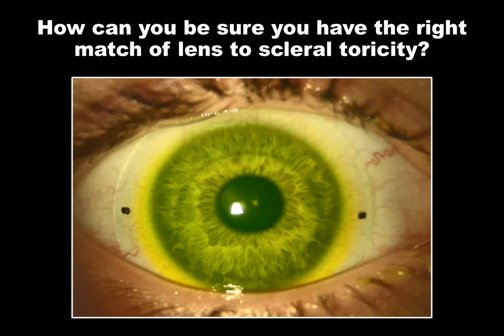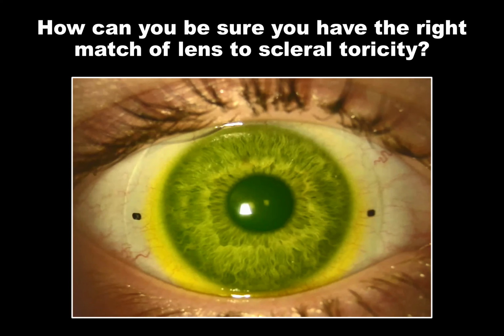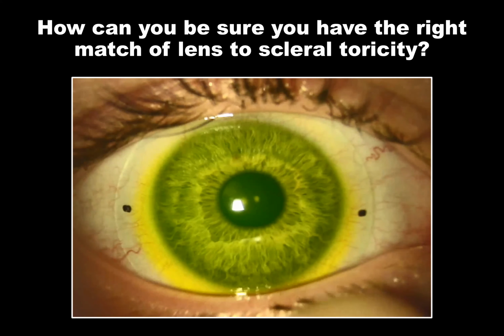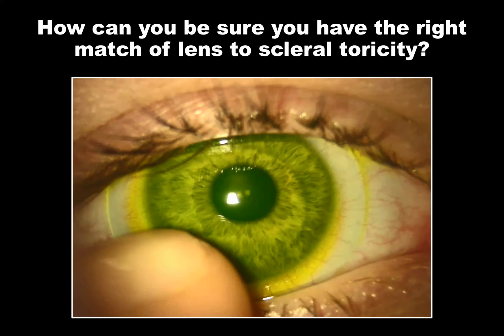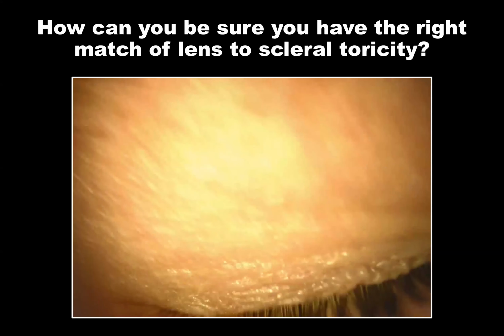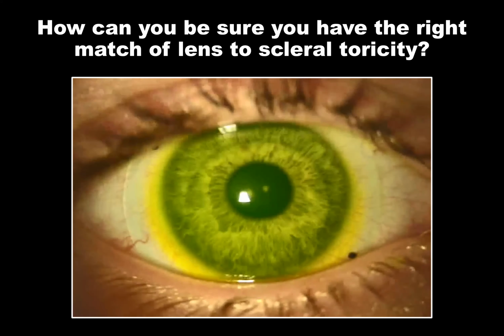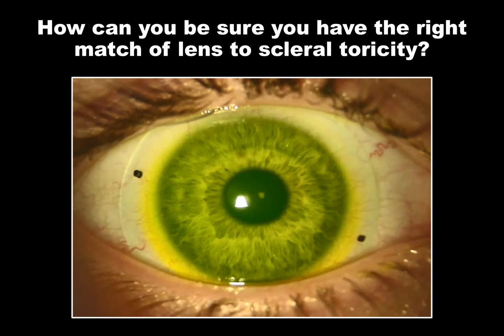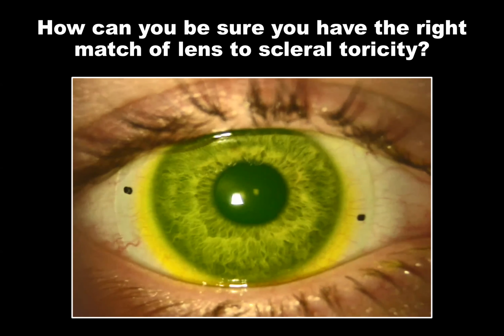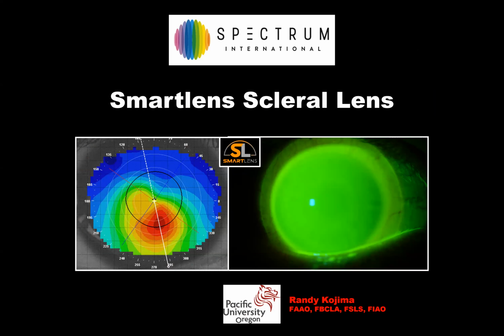So these lenses are very, very stable on eye because in the research by Greg DeNaeyer, they found that something like 6 to 10%, I don't remember the exact number, but it was under 10% of patients have symmetric scleral shape. So that means that 90% or higher have asymmetric or toric scleral shape, and therefore we really should be fitting toric scleral lenses for most eyes. I hope that helps. That helped a lot.